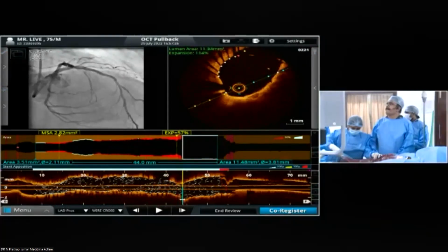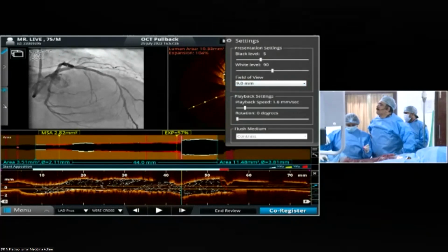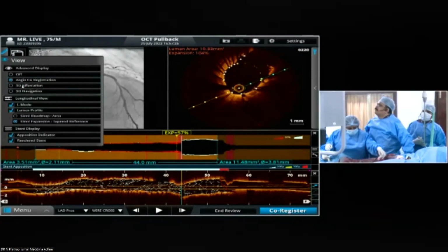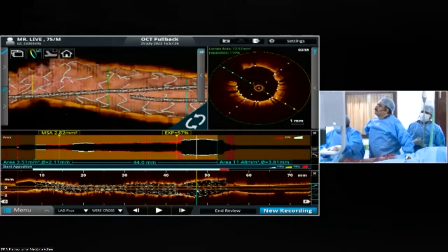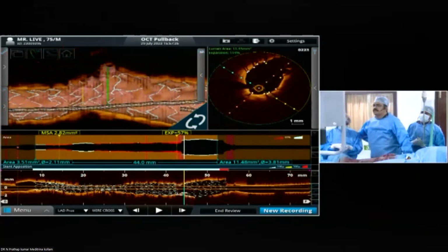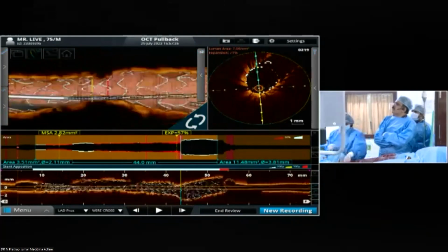You and I were exactly on the same page. That's exactly what I like to do when there's vessel mismatch. We were talking yesterday that in the US, at least, we also have access to a Megatron stent. But this is such a great strategy. And can you show the bifurcation now?